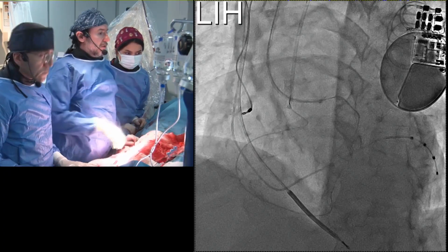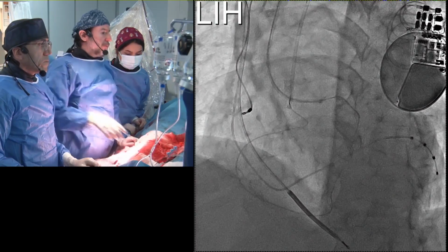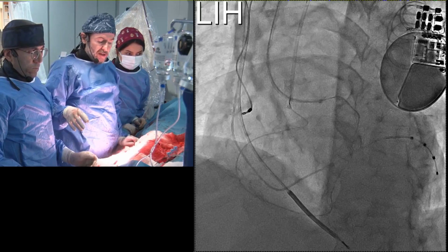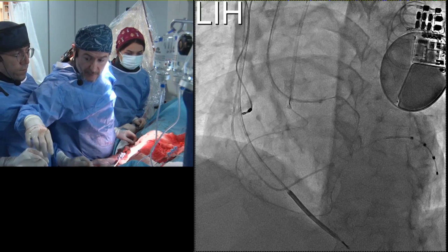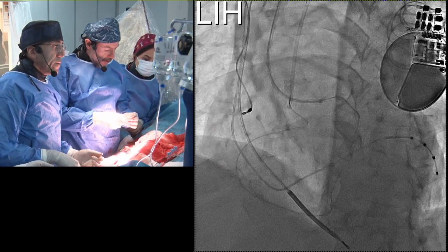Chef, we have two lectures. We will leave you for a while and we will come back. I will put a third wire into the aorta just to prevent the sucking of the guiding catheter into the left main. You record everything in the pictures and show us later. Excellent job. Yeah, okay, thank you very much.